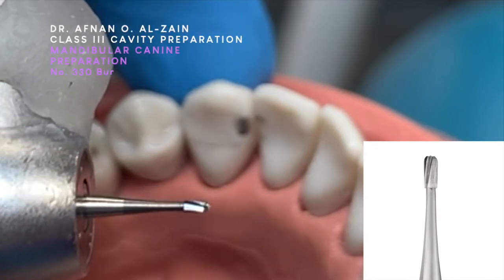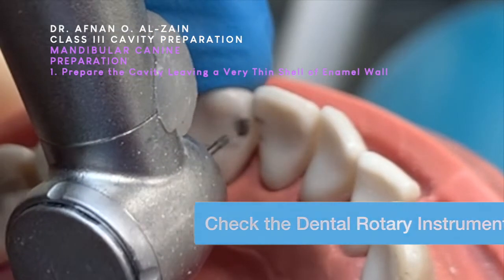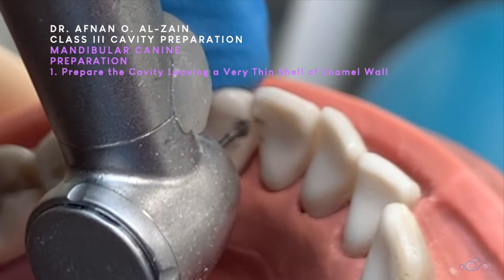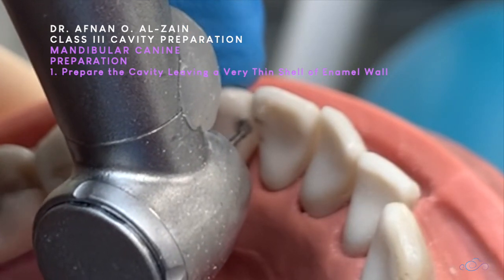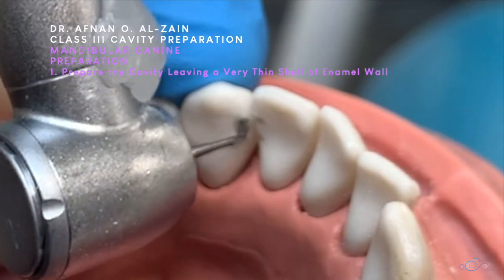We're going to use a 330 bur. The depth of the cavity will be 1 to 1.5 millimeters. We'll put it perpendicular to the tooth surface, and then we're going to access the cavity. We'll set up the box and leave an enamel shell in the proximal. As a class two, we're going to leave a shell of enamel.